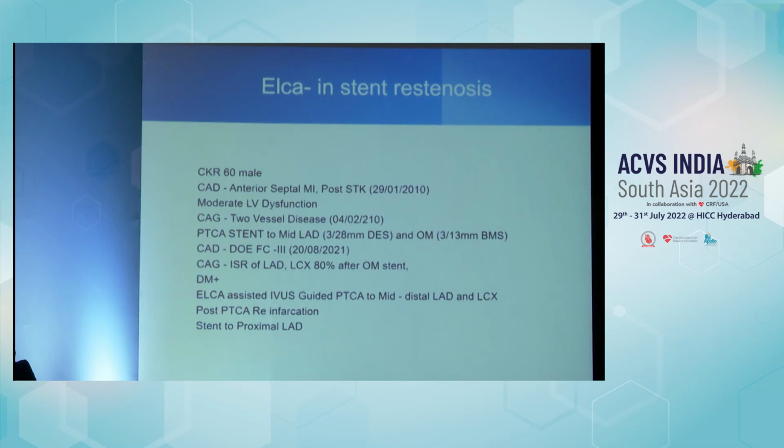But if it is restenosis in a drug-eluting stent, we try to avoid putting another drug-eluting stent, because in most of them it will probably be an under-expanded stent, or there is a lot of fibrous plaque outside the stent which we are not able to break. So what we learned with this laser is, whenever you want to do something outside the stent to soften the fibrous plaque there, if you use laser in the stent, the fibrous plaque outside the stent gets softened. You expand with a cutting balloon, you expand with a drug-coated balloon, then you just leave the procedure with a drug-coated balloon.